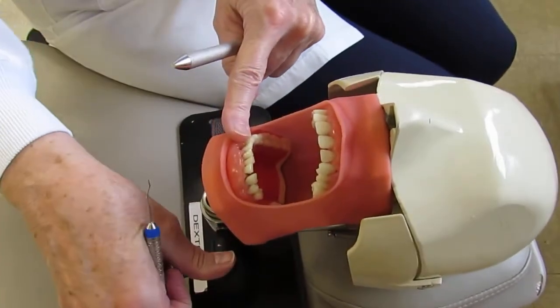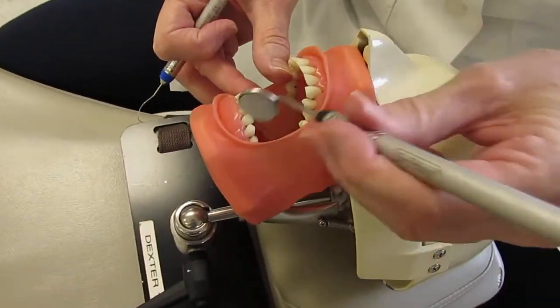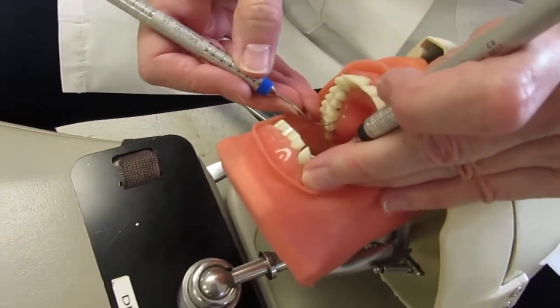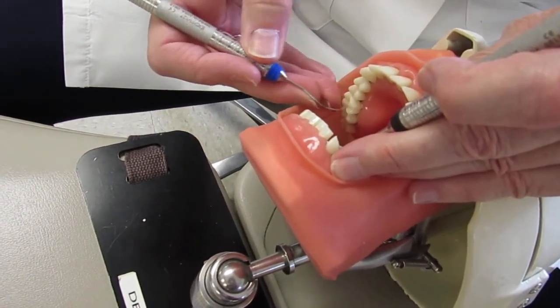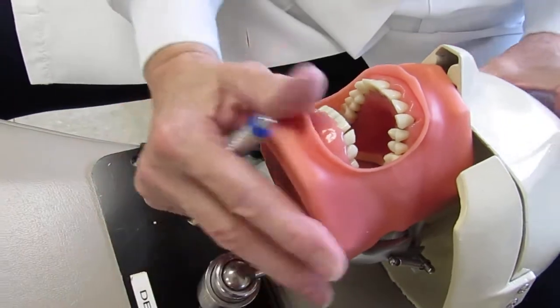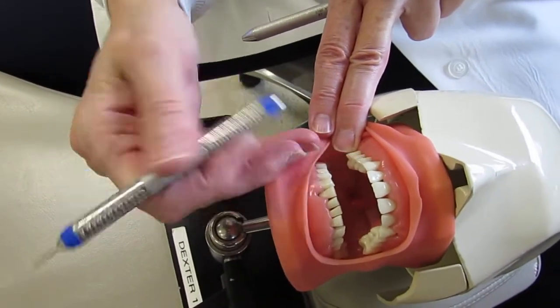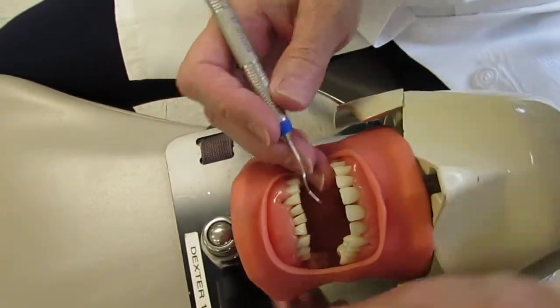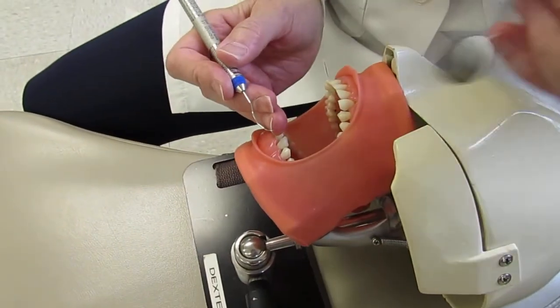For the right side with the patient's head in position, start with the lingual. When first learning, it can be hard to determine the correct working end. If asked to do something like number 3 lingual and you're struggling, figure out the correct working end on the buccal surface first — the lower shank parallel confirms it. Then just flip the instrument and you've got the correct working end for the lingual.